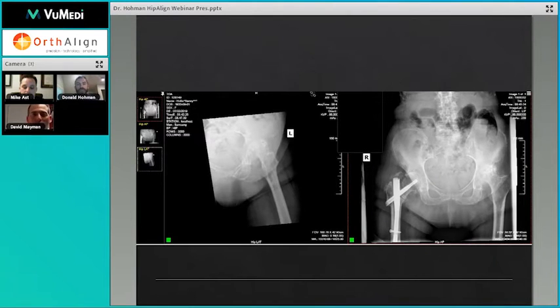So this is a case of a patient. This lady is around 78 years old. You can see she's no stranger to orthopedic procedures. She's got sort of a malunited hip on the right side, but the left side is the one that's really given her the trouble. And what I found with these kind of cases is that these patients have this almost erosive kind of deformity. When you expose this hip, there's a lot of heterotopic bone. There's difficulty with identifying some of the landmarks that you might use to position the socket in your routine setting.